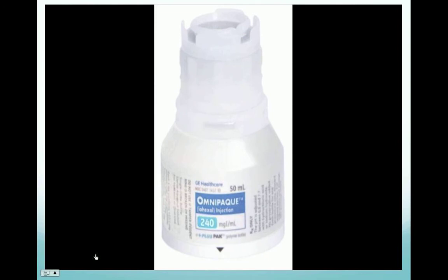In order to confirm catheter placement, contrast dye is injected into the catheter, mimicking medication. Here's a live film as we inject the dye. Be sure to look for the darkening areas. This shows us the spread of numbing medication in the epidural space, which will numb the nerve roots in the targeted dermatome.